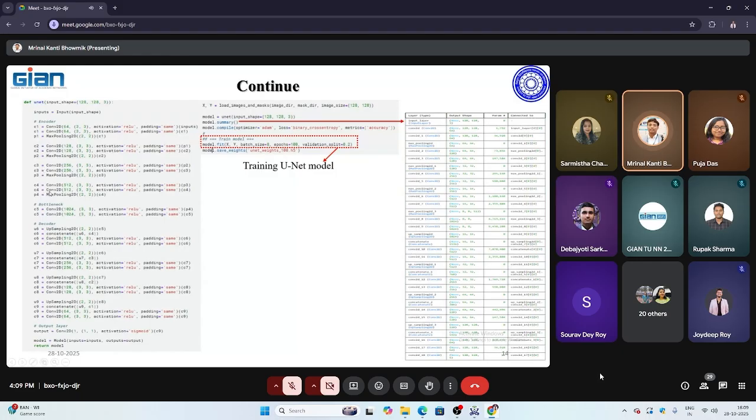C4, meaning block 4 of the encoder, as I have explained. Then again two convolutions are performed subsequently, and in this way block 7, block 8 and block 9 have been done. Then finally, which is an important part in this U-Net, to give me a binary mask as an output.